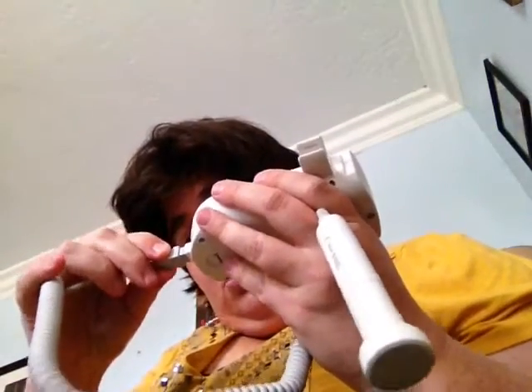Let's put these stinkers in. Simple, easy. If I can do it, you can do it. Put them in, clip. And then you're going to have your, I don't know what to call this thing. Your male, female, and you just push it in. And so that's in. And so it's going to be loud, so bear with me. Oh, I'm so quiet.